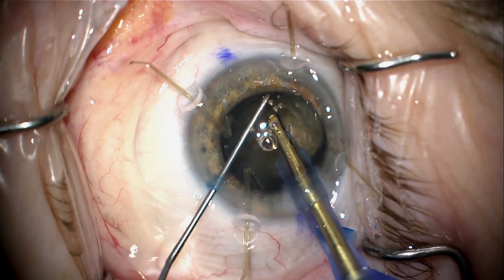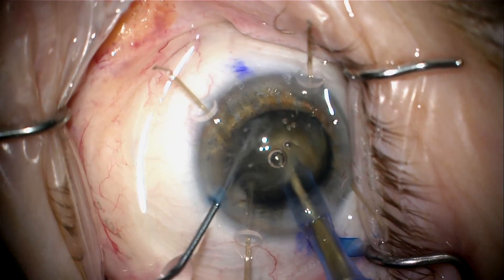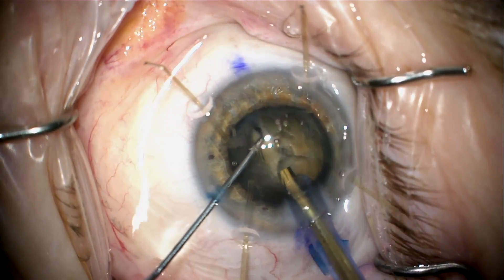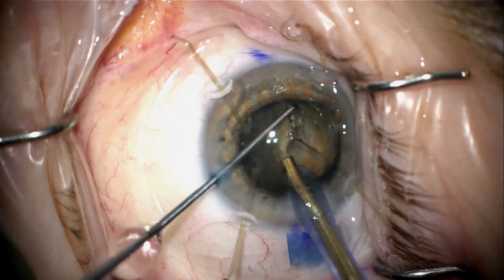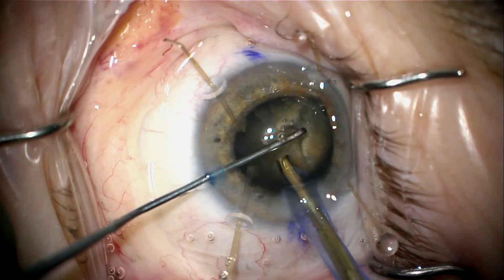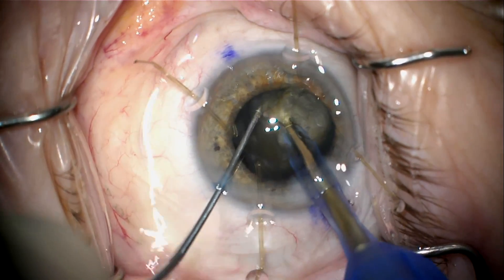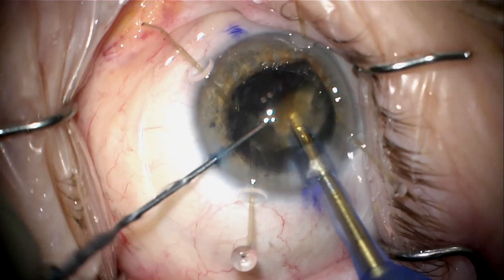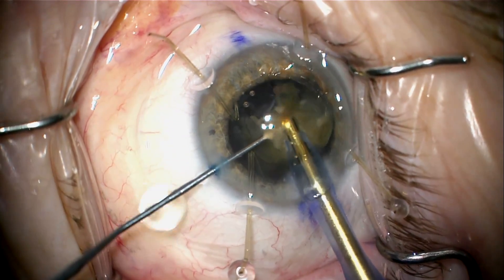I'll now go ahead and do a phaco-chop technique. This is a very dense central nucleus. The capsular bag is supported by the capsule retractor, but you still want to be very careful not to stress the capsule and create a radial tear, which is easy to do when the anterior capsule is being supported by the capsule retractors. You want to be very careful not to buzz the elevated anterior capsule with the phaco tip, because that will cause a radial tear and you'll be unable to use the capsular bag.